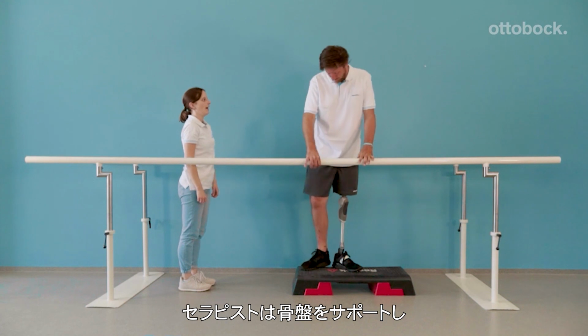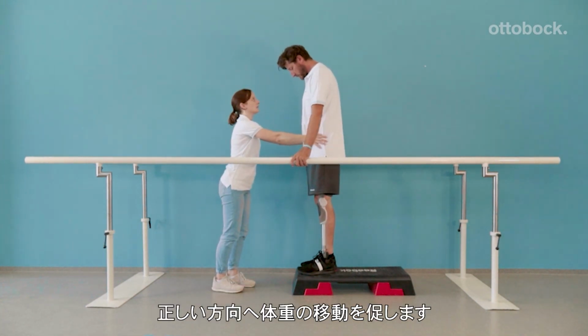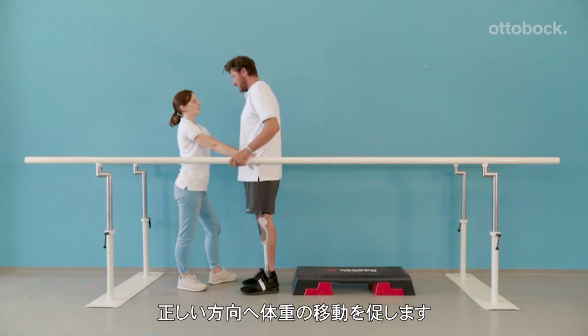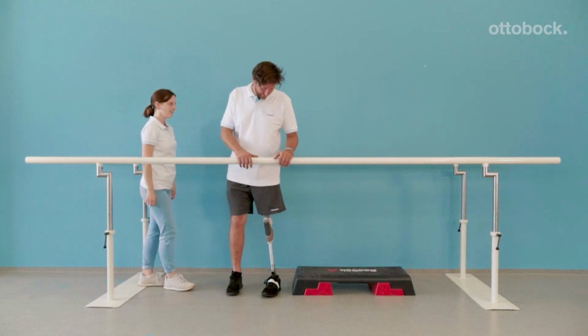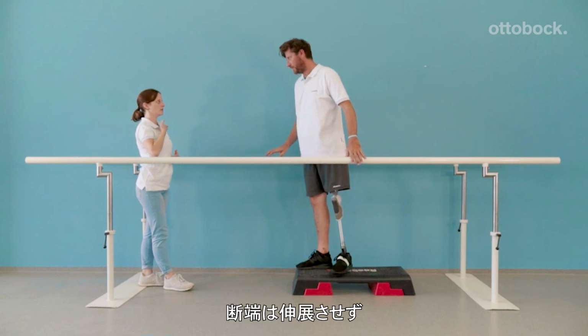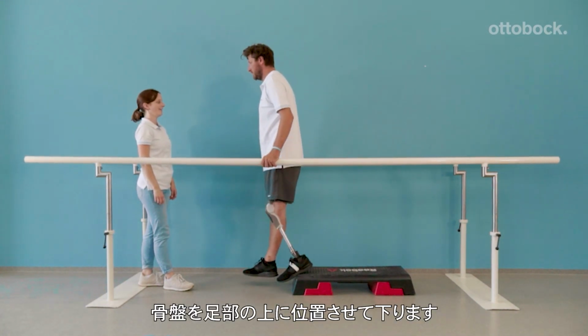With support at the pelvis, the therapist is able to initiate weight shift, control the direction of the movement, and correct deviations of the pelvis. A correct downstairs movement is made with an upright posture, while the pelvis stays over the foot. Avoid residual limb extension.